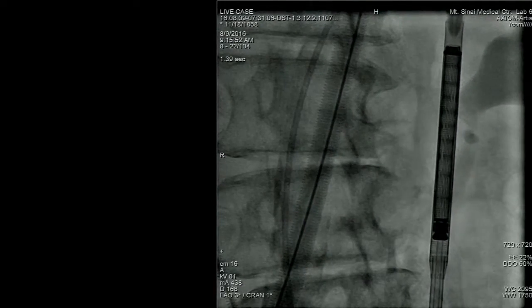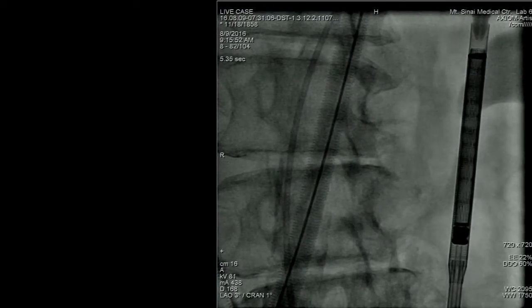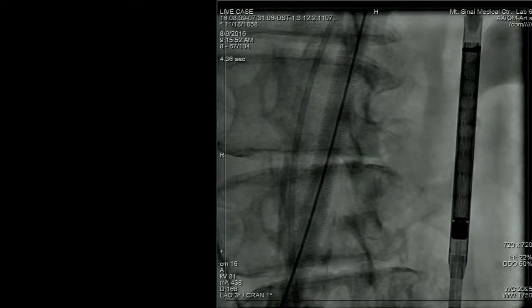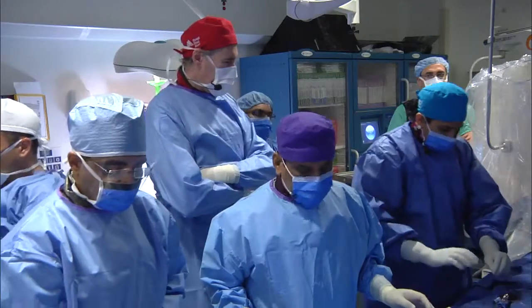Okay. Dr. Sharma. All right, let's go. So we are ready now. What's the ACT? Good. So all done with the heparin. You want to go a little LAO view? Let's cross slightly. We have a previous angiogram that shows that the arteries are fine. Is that correct? Yes. The non-obstructive CAD, yes, absolutely.